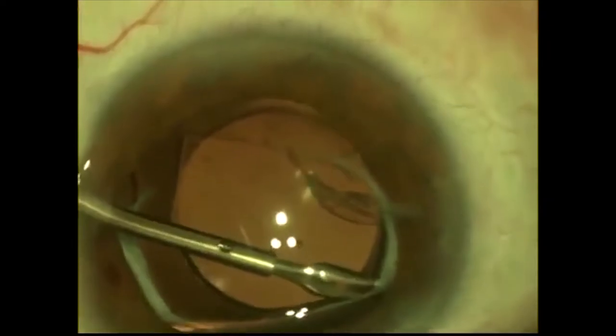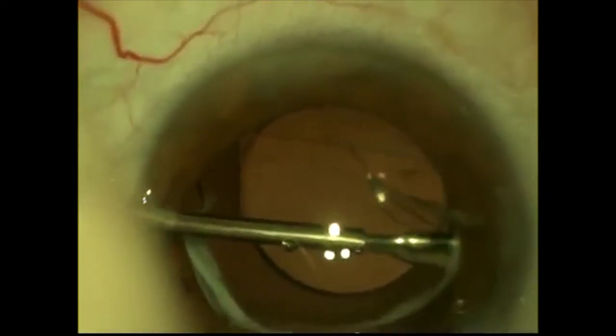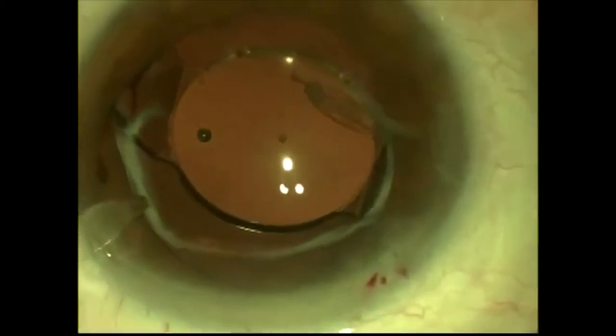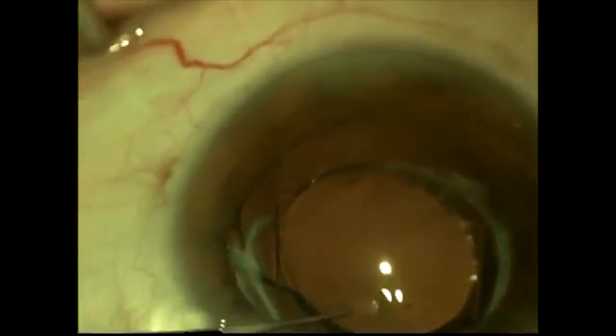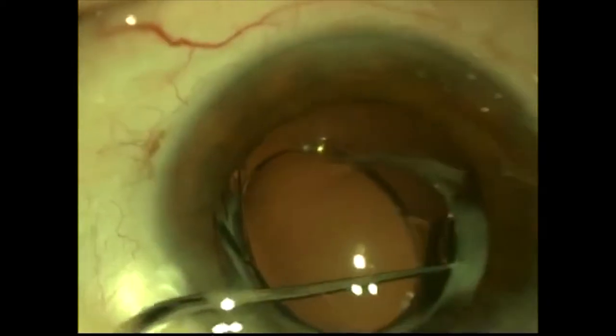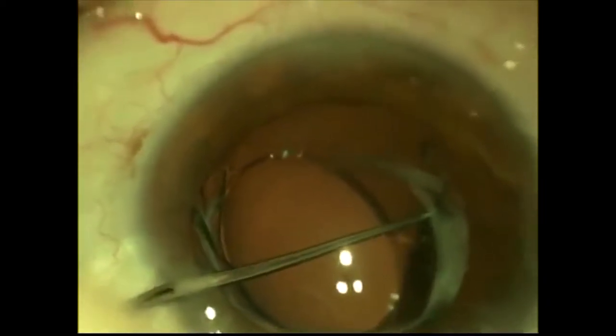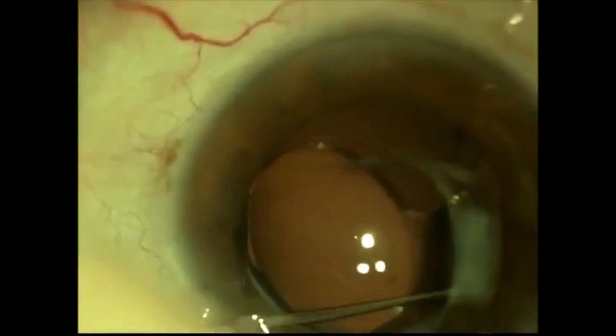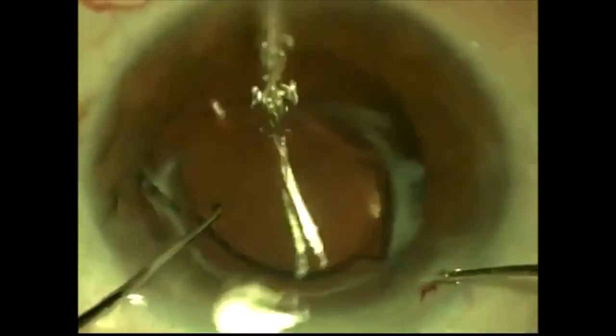My decision is usually to try to get the haptic back into the bag. However, the lateral haptic on the right side of the field is so fibrous that I felt the best approach was to investigate using the endoscope again to see the position of those haptics. They were in good position but extremely fibrous. A year out, it gets a little difficult. We did tease away and try to remove them, but there was really no change on that side of the eye. I tried rotating the lens 90 degrees to get away from the most fibrous part of the capsule, but we were just tearing zonules and it didn't look like an effective method.